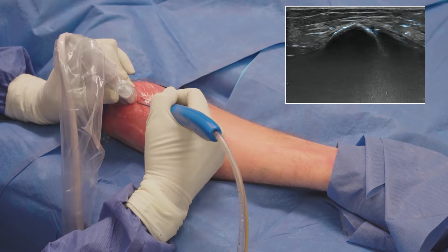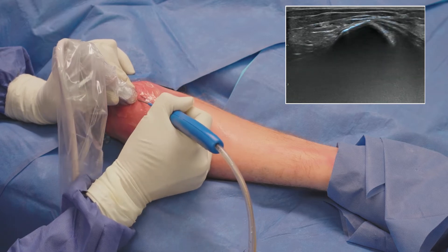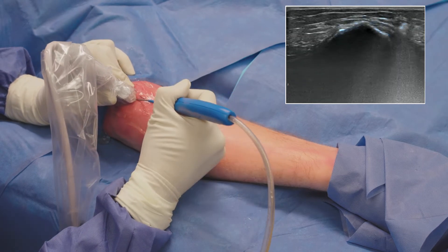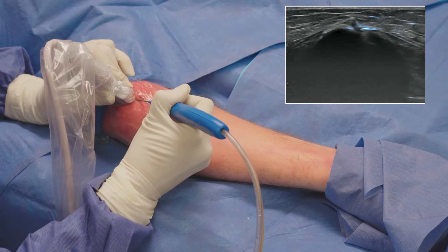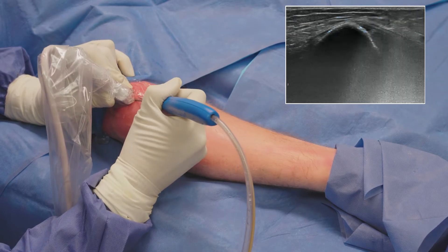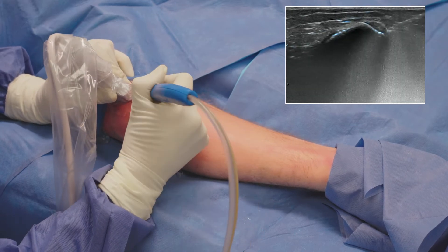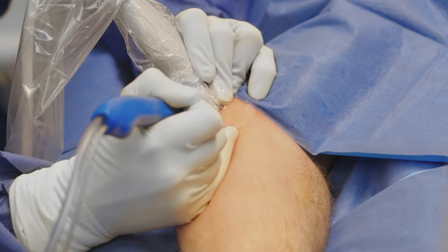When the device is in the proper position, I depress the foot pedal to initiate debridement using the high-velocity jet of saline. When debriding the diseased tissue, I motion the device in a gentle pistoning motion forward and backwards, or rotating the device to reach all of the pathology that is causing pain for the patient. I go deep into the tendon but also debride the superficial fibers to ensure uniform healing throughout the tendon.